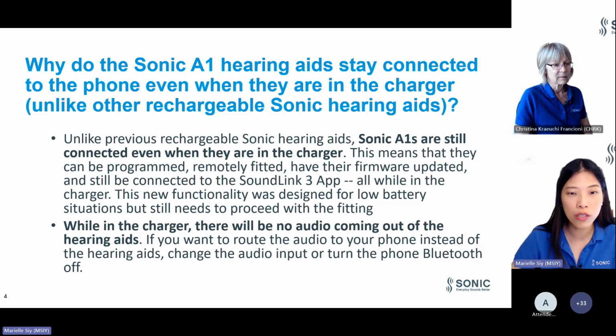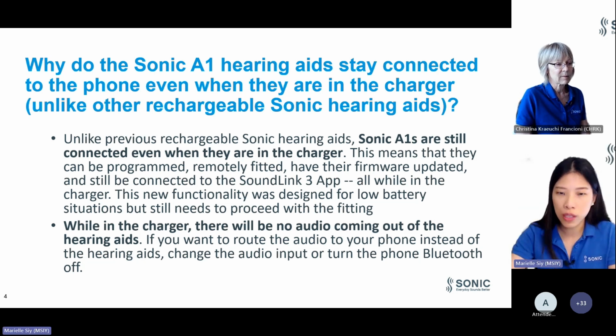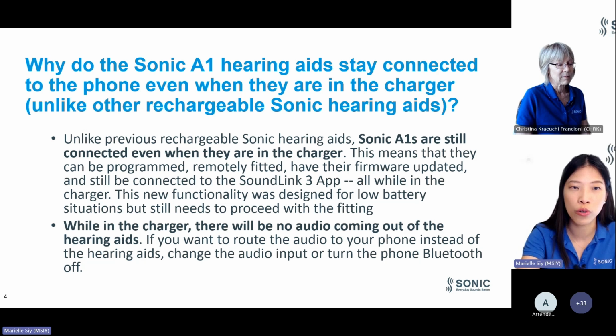And while in the charger, there will be no audio coming out of the hearing aids. So let's say you're trying out the Sonic A1 hearing instruments and you're playing some music from Spotify. And then you decide to put them on the charger because you want to charge them. But then when you play the music on your phone, you don't hear it coming out of your phone. That's because it's still connected to your Sonic A1 in the charger.